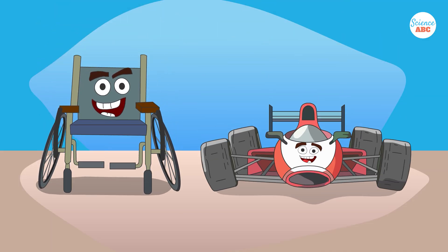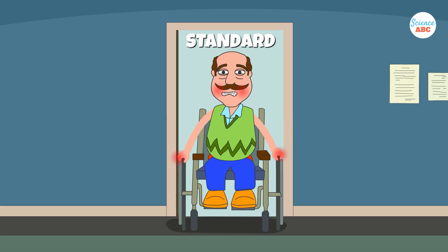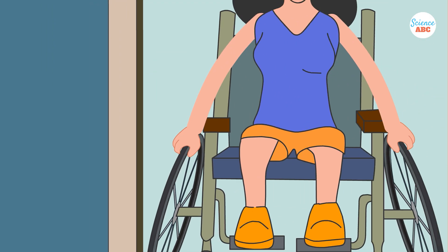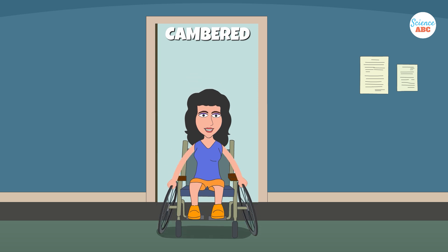There are many practical advantages of cambered wheels for all wheelchair users, not only athletes. For example, with a negative camber assembly, the top part of the wheels is closer to the user, reducing the likelihood of scraping their hands against surfaces like walls and door frames when navigating tight spaces.